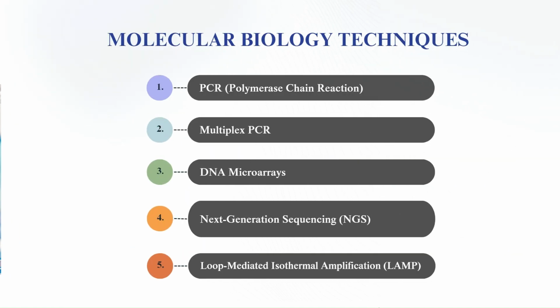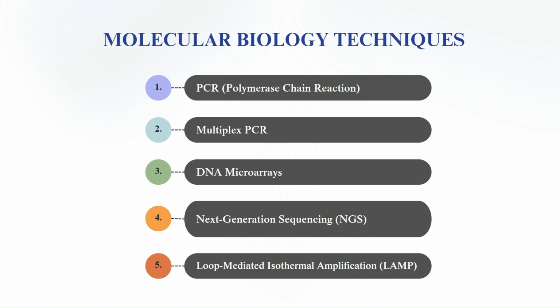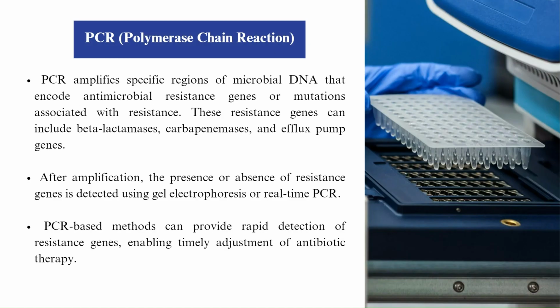Commonly used molecular biology techniques are PCR, multiplex PCR, DNA microarrays, next-generation sequencing, and loop-mediated isothermal amplification, LAMP. We shall see them one by one. PCR. PCR amplifies specific regions of microbial DNA that encode antimicrobial resistance genes or mutations associated with resistance.